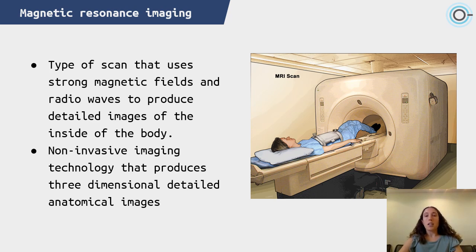On the one hand, it allows for a better tissue characterization through different MRI sequences. It does not expose patients to ionizing radiation and has also been proven to have a higher sensitivity in detecting muscle disorders with smaller inter- and intra-observer variabilities.